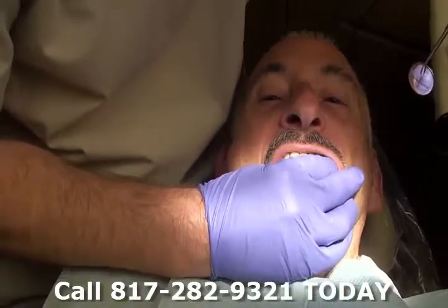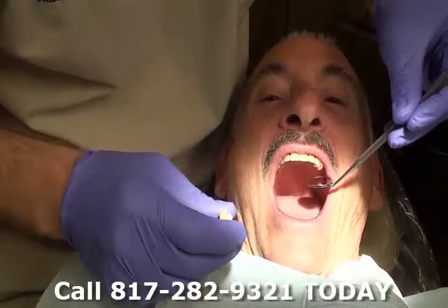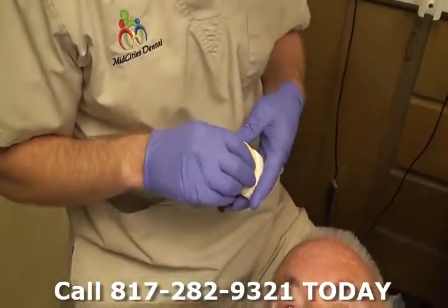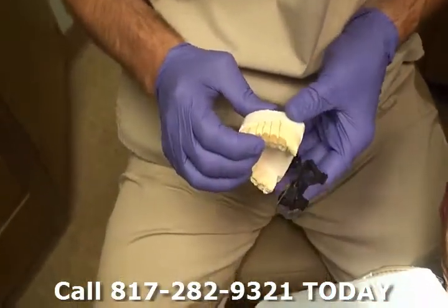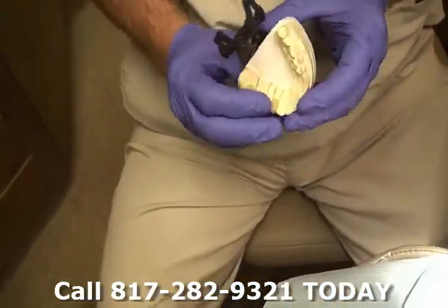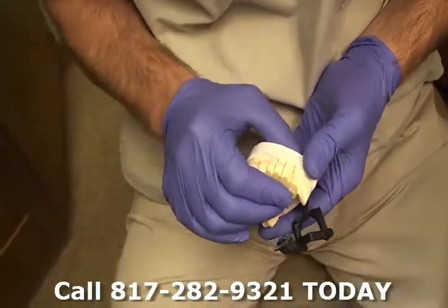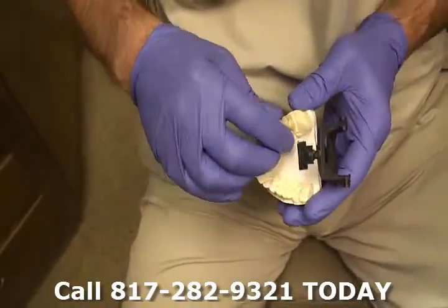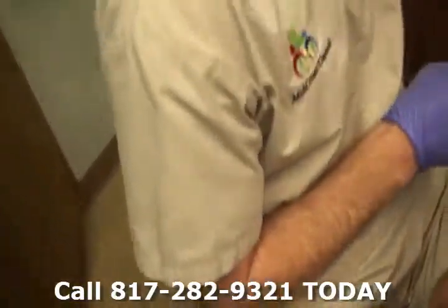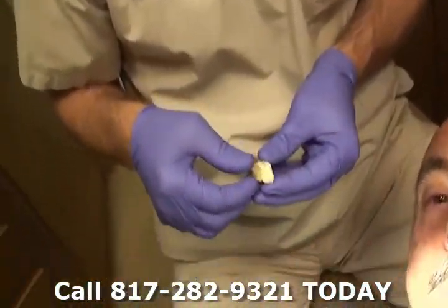I'm going to take it off. Let me look at it on the model. It's a little bit wobbly. What I like to do is look at it on the model so I can compare what it looks like in your mouth — another way of determining accuracy and seeing that what the lab sees is the same thing you see. We have a secondary model just to do the same thing.